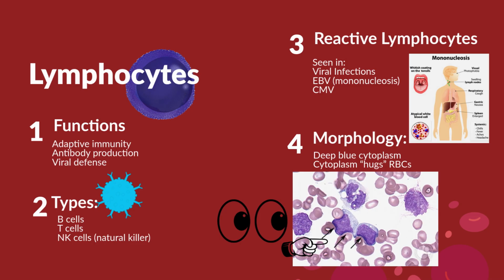Now, don't go overboard with this. The name of the leukemia is in the name. It's chronic lymphocytic leukemia, mature appearing lymphocytes and smudge cells. There'll be a bunch of those.